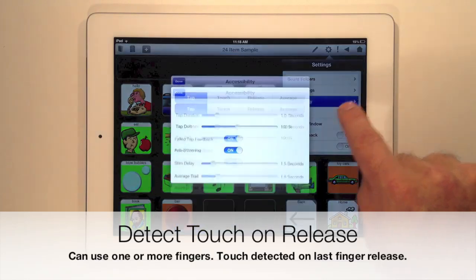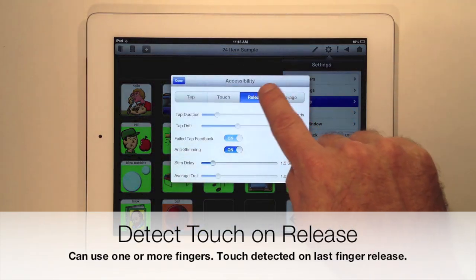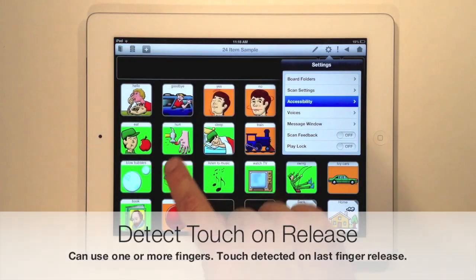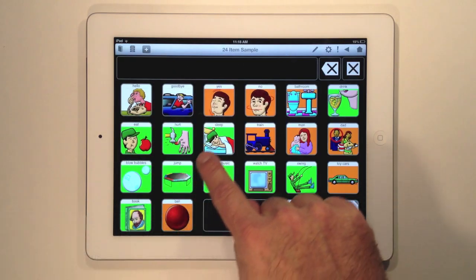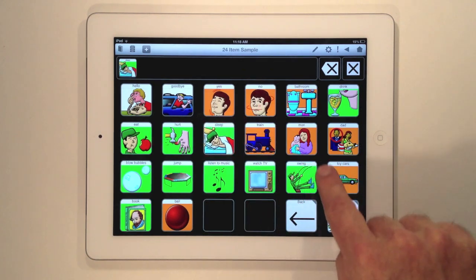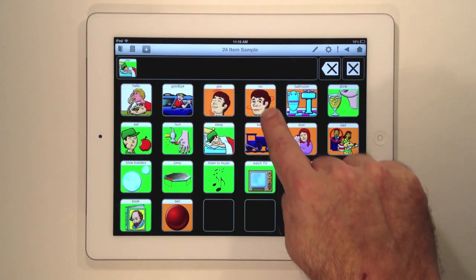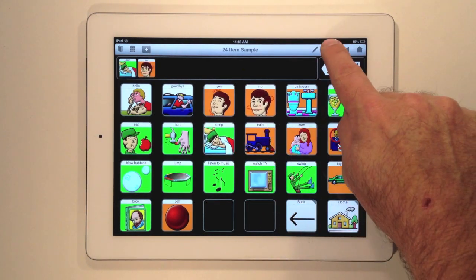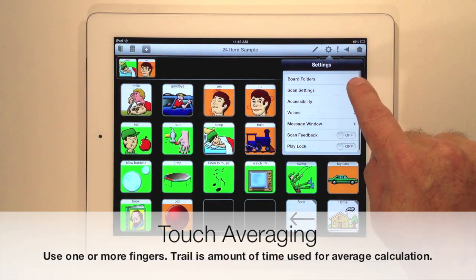Detect Touch on Release lets you make contact with your iPad, move your hand around, and release your hand on the button that you want to actuate. You can use this with one or more fingers.